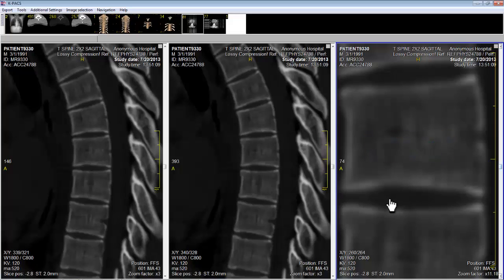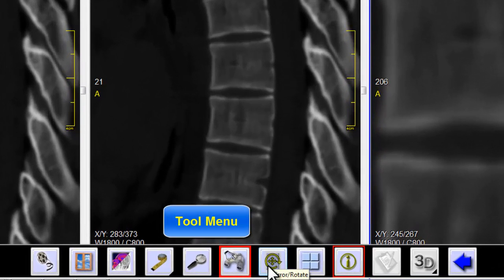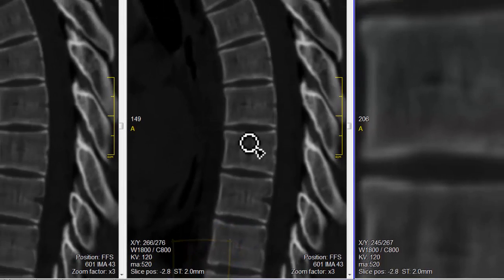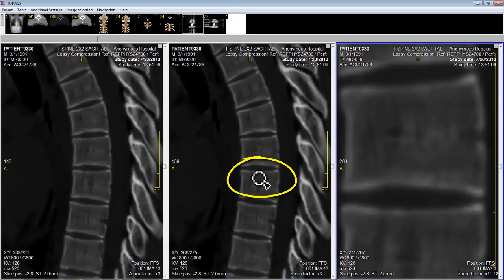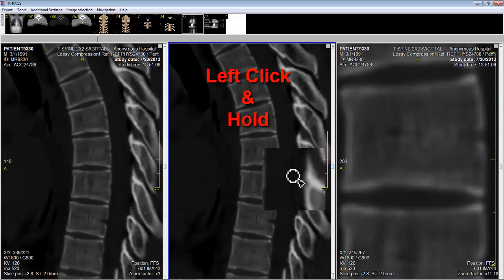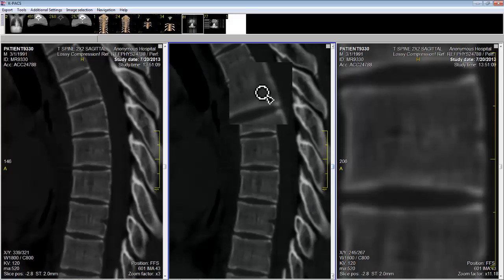The next tool that I want to discuss is called the magnifier. To activate the magnifier I move my cursor to the bottom of the screen until the tool menu is activated, then I click on the magnifier icon. Now my cursor looks like a magnifying glass. If I put the magnifying glass over the area that I want to look at under a higher power, I left click and suddenly I have a small area of magnification, just like a magnifying glass.